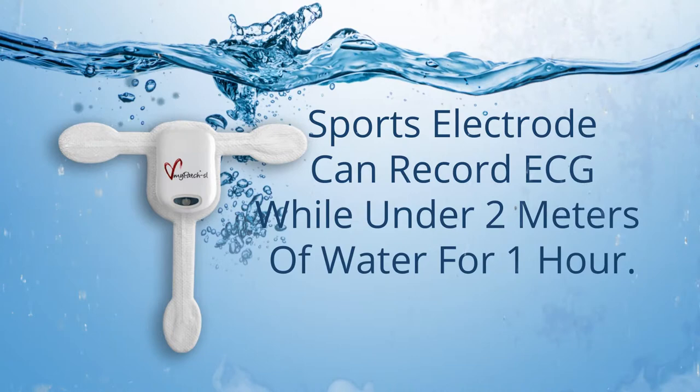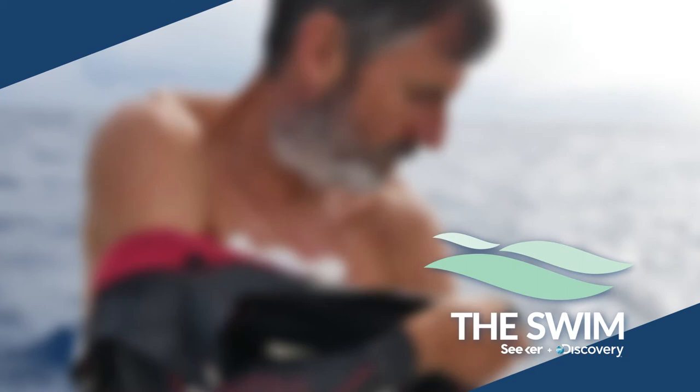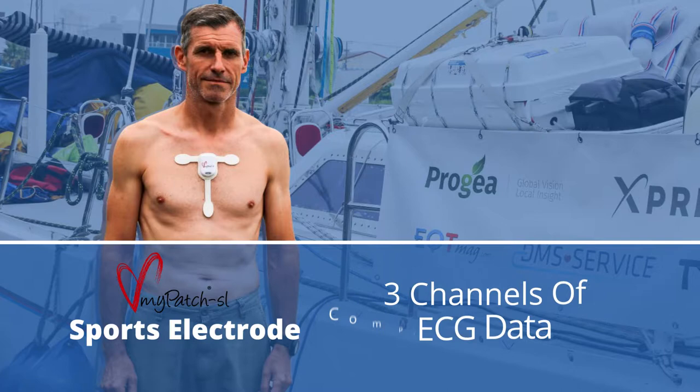Using the sports electrode, the device can record ECG while under 2 meters of water for one hour. In fact, Ben Lacombe is proudly wearing the MyPatch SL Holter Recorder on his epic swim from Tokyo to San Francisco. The MyPatch SL sports electrode has been specially designed for swimming and allows for submersion in water and 3 channels of ECG data to be recorded without the use of a lead wire.